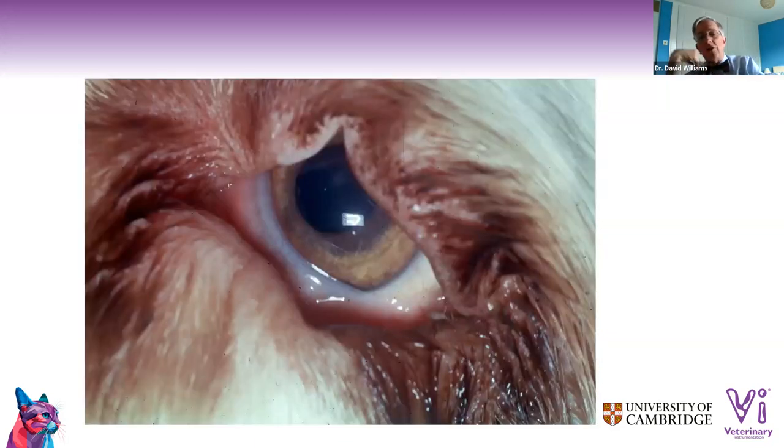So here are these diamond eyes. It's a Cavalier Spaniel. And we have real problems with these. I mean, that's one of the reasons they give me a job, but also one of the challenges, is that we've developed eyes that are just not fit for purpose, really. So here we've got a potential ectropion at the top and the bottom of the diamond, and then entropion on the inside. There was a very complicated technique called the Wyman lateral canthoplasty, where you took strips of muscle and moved them all around. All you need to do here is a little Hotz-Celsus procedure, a little strip of skin taken away from this point.